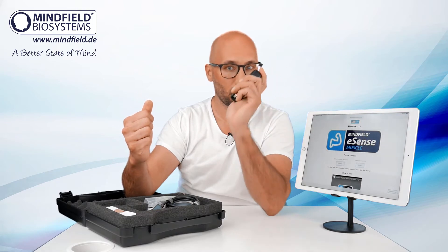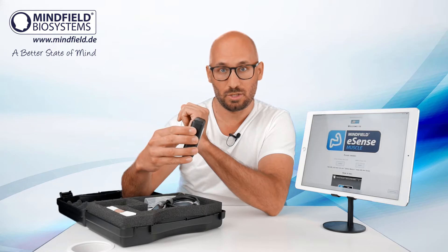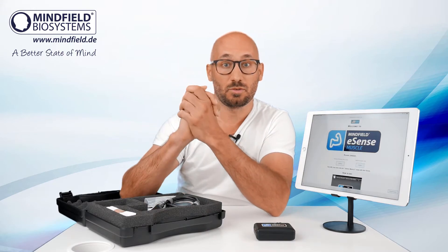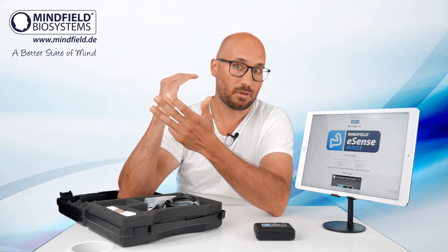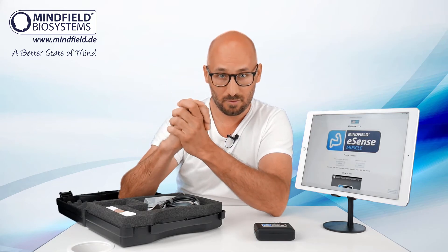It's small, it's lightweight, portable, and it comes with the latest Bluetooth technology for direct connection to your device — making it possible to use with a computer, with Windows, with Mac, with Linux, but also with iOS, iPad, iPhone, or Android smartphones and tablets.